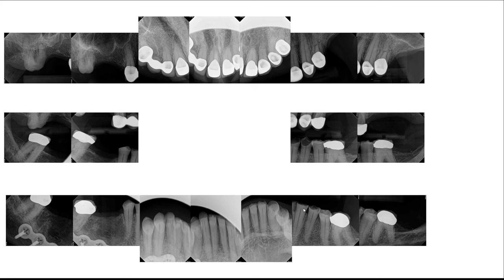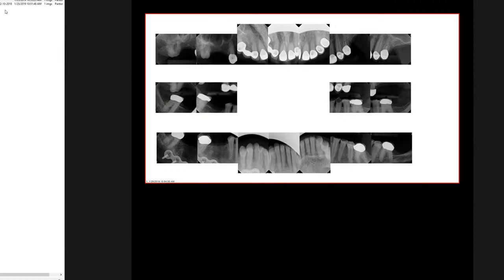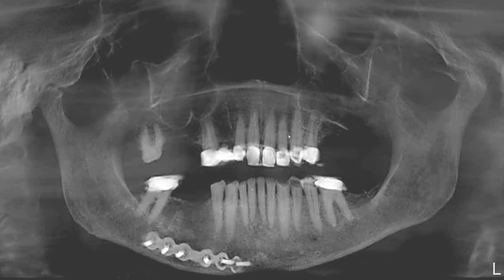Another interesting area I want to point out is this metallic fixture visible at the edge of this posterior PA. You can clearly see the bars as well as the screws. Now I'm going to show you another imported image on this patient — a reconstructed panoramic image from a CBCT scan. We can now visualize the full extent of the maxillofacial region, and you can see that this patient must have sustained a jaw fracture, hence this metallic fixture is visualized.